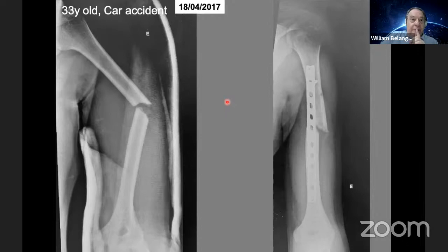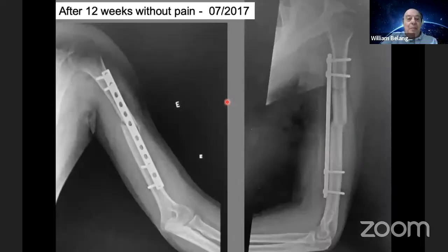You can see that the surgeon tries to fix it with a screw in the 3rd hole, but he can't because the reduction was not good. The decision made was to fix using the 2nd hole. Okay, this decision unfortunately was wrong. The correct decision was to reduce the fracture again and better. Okay, let's see what happened.